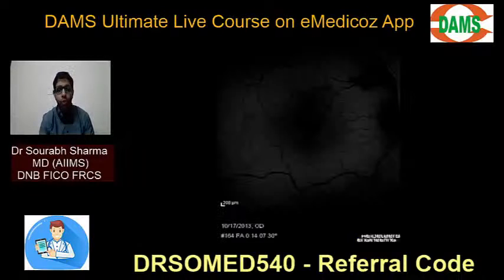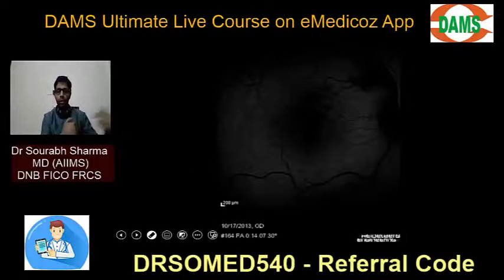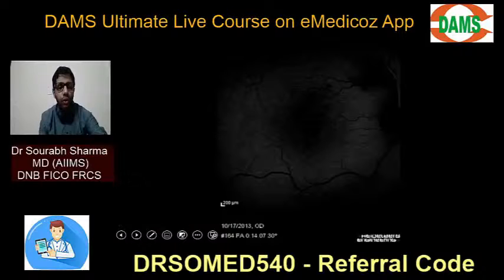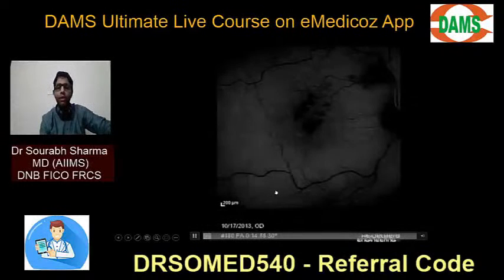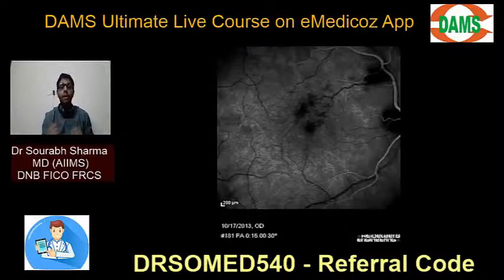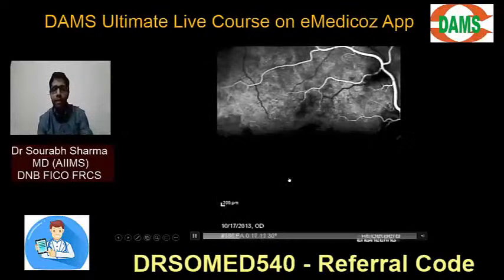Okay? I'll show you a video and tell you how this normal angiography works. When you put a dye, it goes to the heart. From the heart, does it first go into choroid vessels or retina vessels? First it goes into the choroid vessels, and then it comes into the retina vessels. I told you, arm retina time is 11 seconds. You have to remember that. But first the choroid vessels are filled and then the retina vessels. See, the retina vessels are filling now.